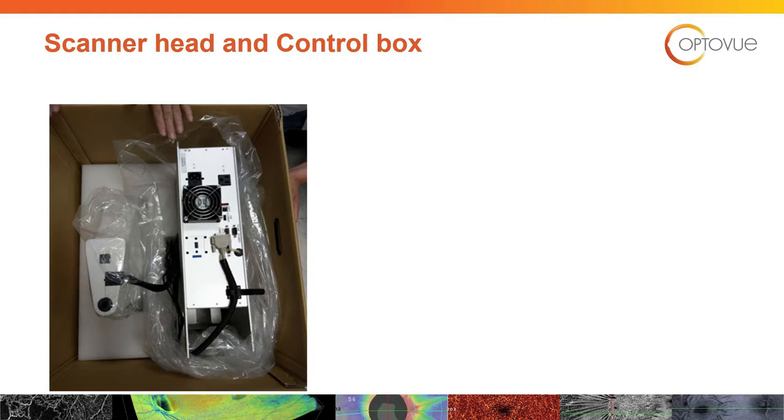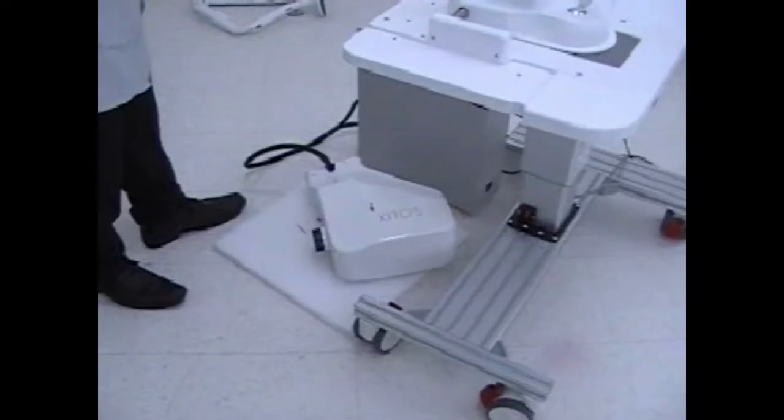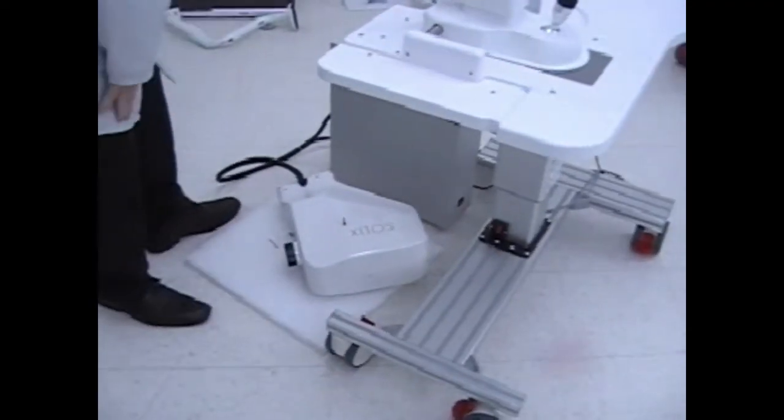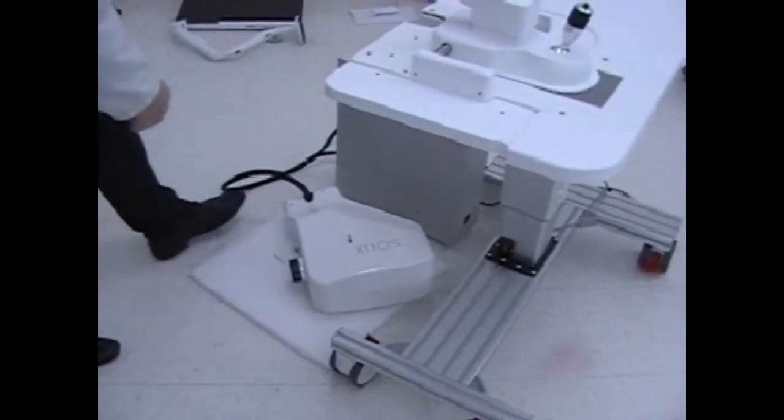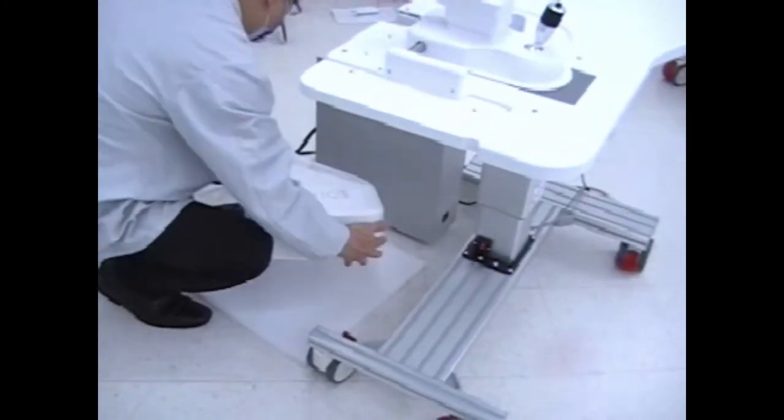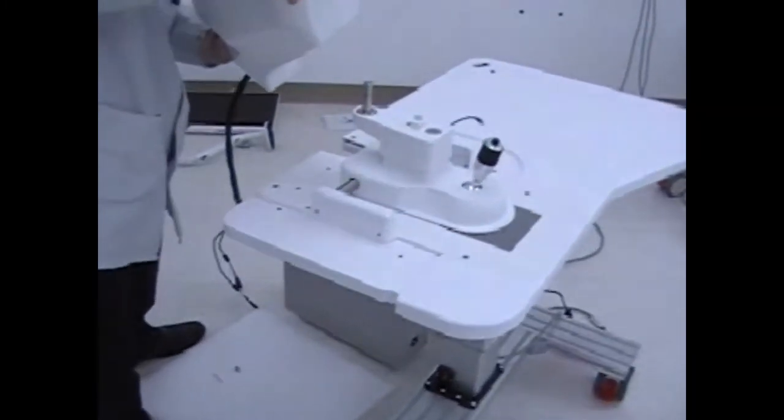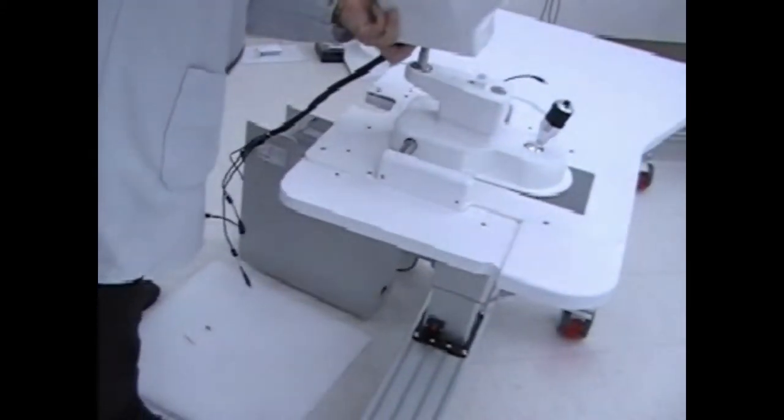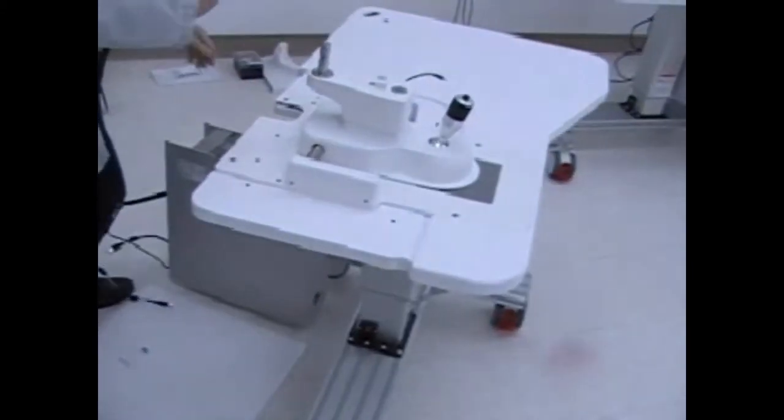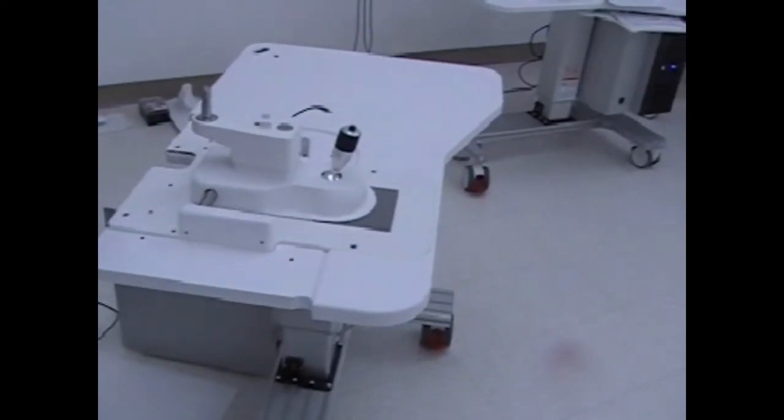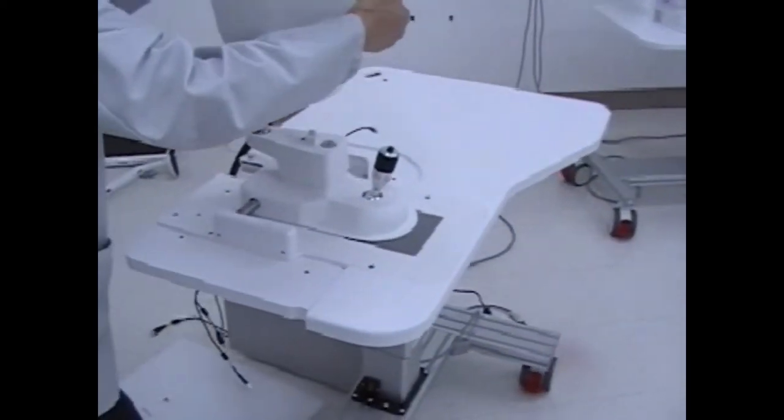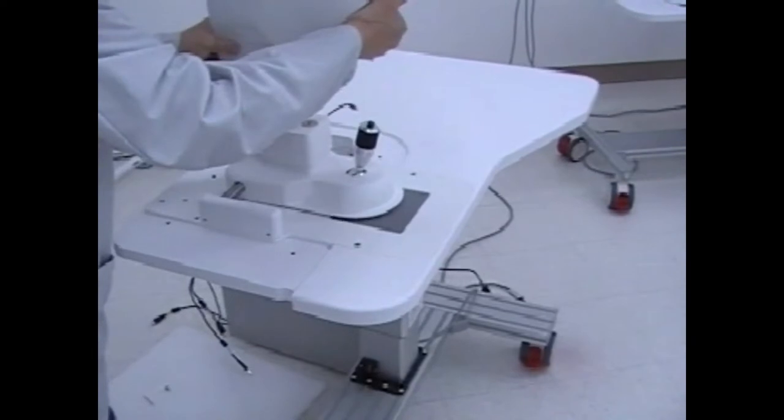Take care when lifting the scanner head and control box from the packaging. Make sure that the control box and scanner are close enough to the table so that when you lift the scanner head up to place it onto the joystick assembly, you do not put unnecessary tension on the cable. You may have to adjust the table height and the location of the control box.